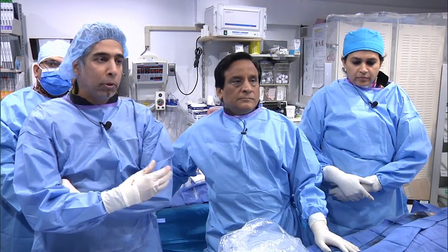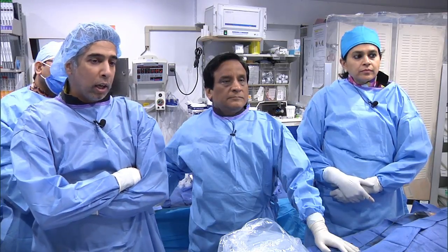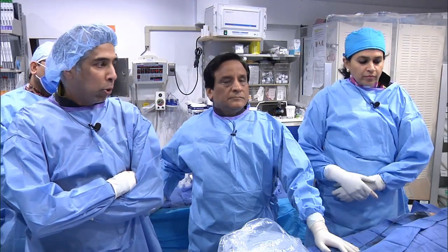But again, I would stress that particularly in a lab like this where there's very complex interventions, there has to be a very thoughtful process in terms of determining access. One of the major limitations of transradial access had been limitations in guiding catheter sizing. Certainly bifurcation lesions that require a 7 French system, as we see today, would have been something that only 3-4 years ago we would have been much more reticent to do.